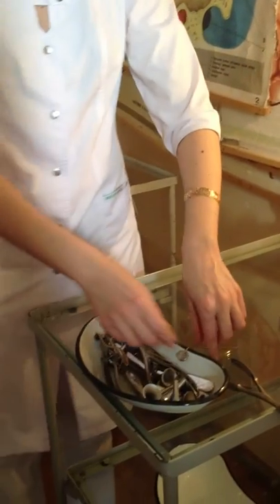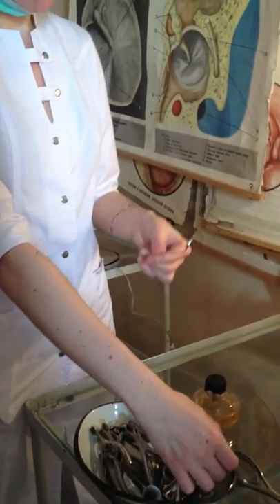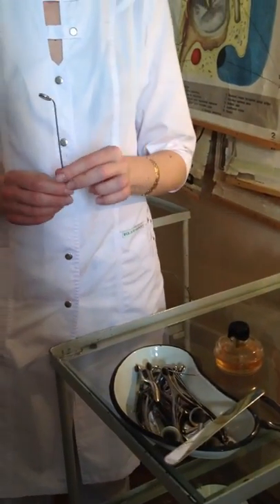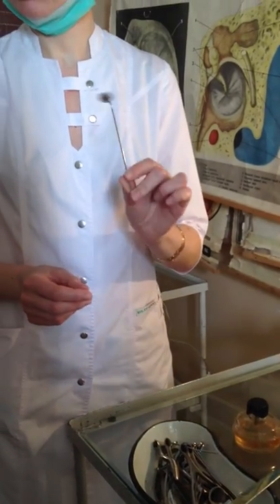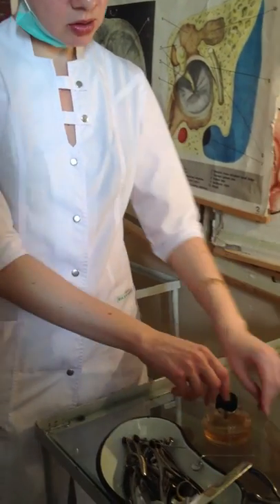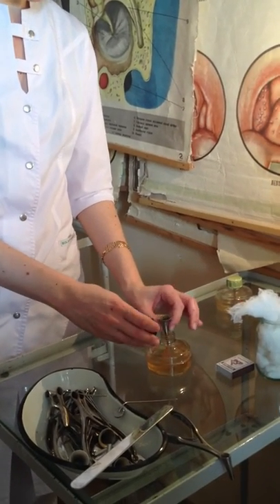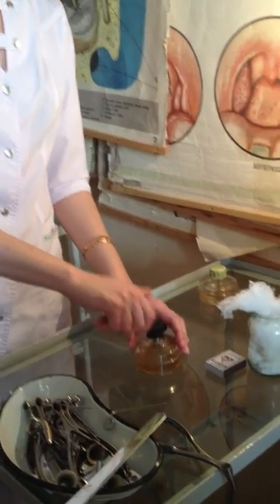For posterior rhinoscopy we will use this small mirror. The name of this mirror is the nasopharyngeal mirror. And for this method of examination we will use the tongue depressor.